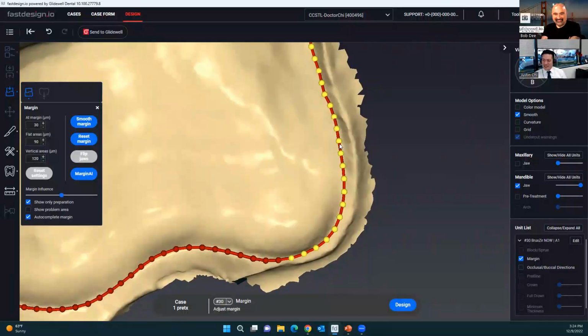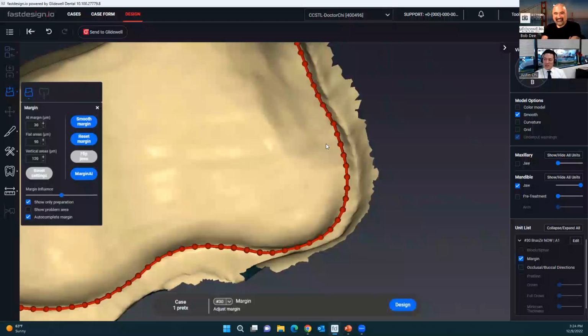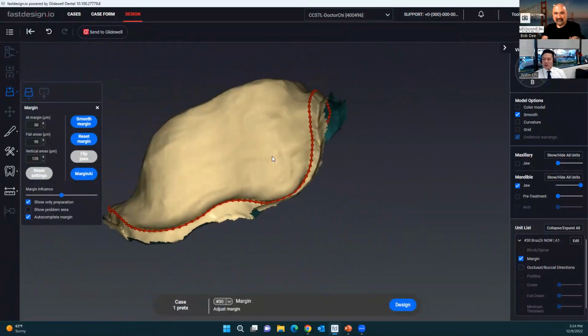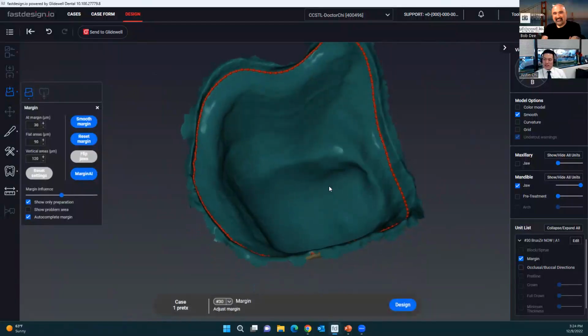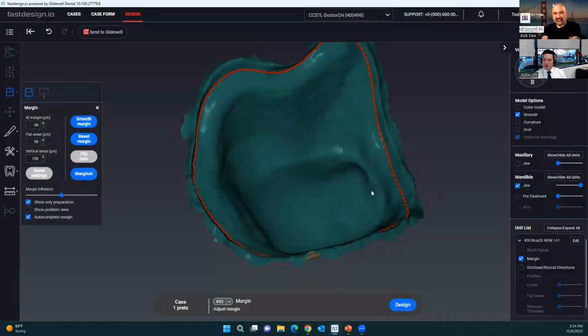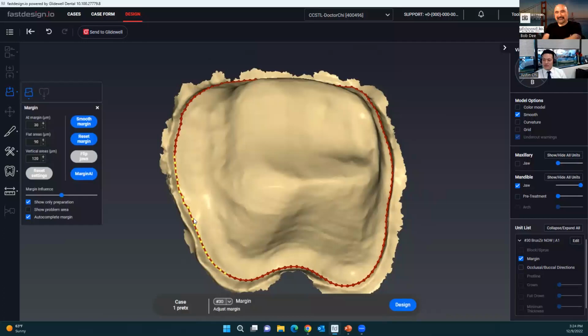You can spend a lot of time evaluating your margin as needed, and there are several different ways. I turned it upside down, or around, because there are some users who prefer looking at it like an impression, so you can edit the margin from that view too. Yes, it becomes fun. Absolutely, there are a lot of different ways you can go about using the software.